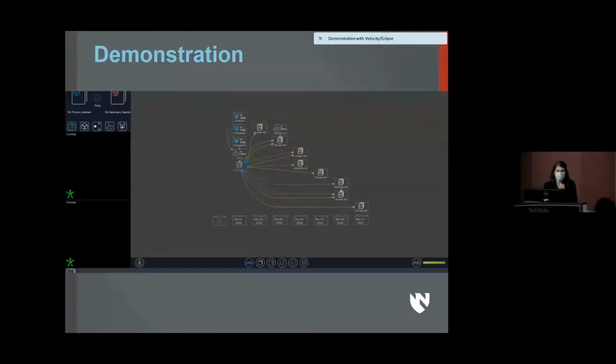So the first demonstration is going to go pretty fast. It's only a 1-minute clip, but it's going to show one of the workflows that Velocity has. And because it goes so fast, it'll show you how efficient this process tends to be. What I've loaded here is a patient with a number of plans on their original CT, and then all those subsequent images that you can see down the line are their cone beams, and they already have online registrations from the machine loaded.